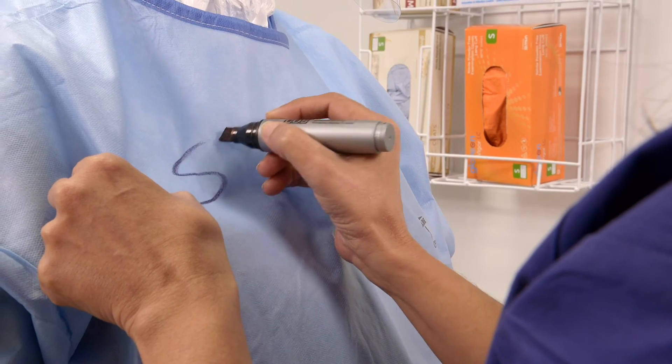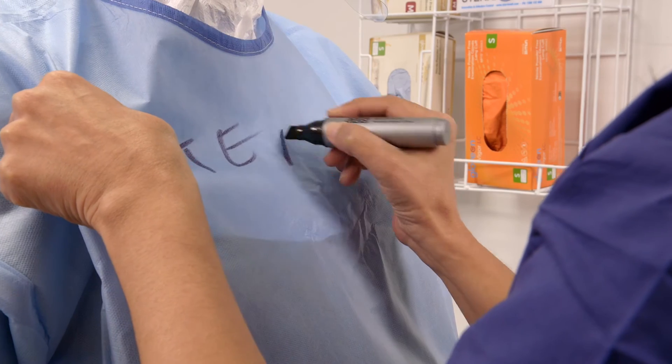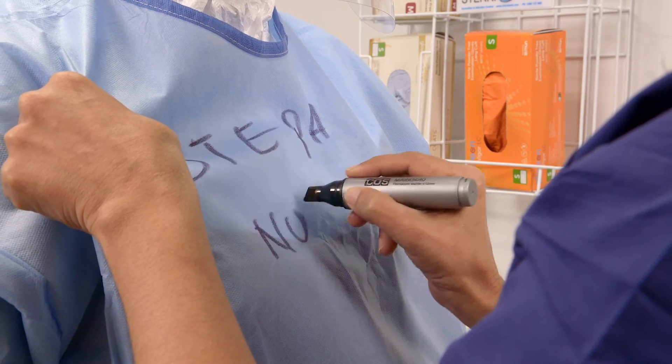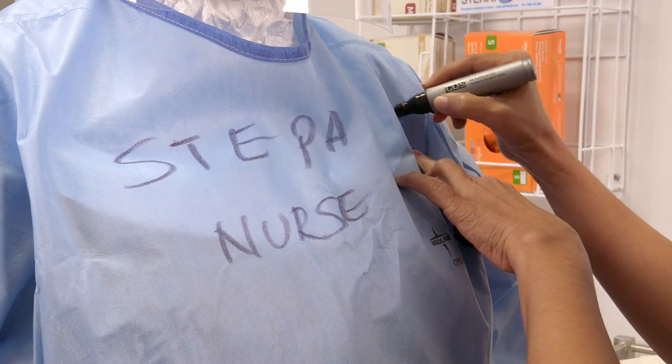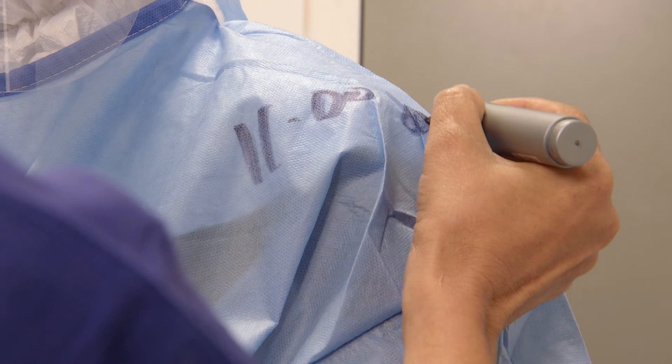Having a buddy write your name, role and time to the front of your gown will assist the patient with identifying who you are when in the room. Adding the time to the gown allows you to identify how long you have been in the PPE.